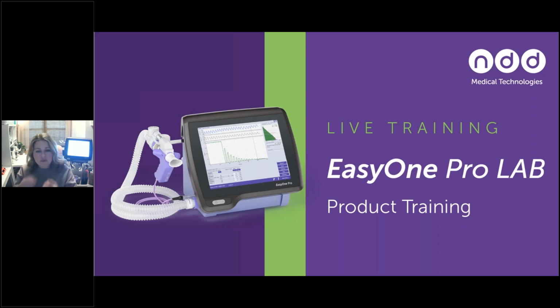If they are ill fitted, not secure, too big, too small, then obviously they're going to be more of a hazard for your seal than a helper. So just confirm that they are well fitted and well secured, because then they'll keep a much better seal with them in place versus taking them out. So really it is dependent on the patient. If they fit well and are secured, leave them in. Otherwise, take them out.